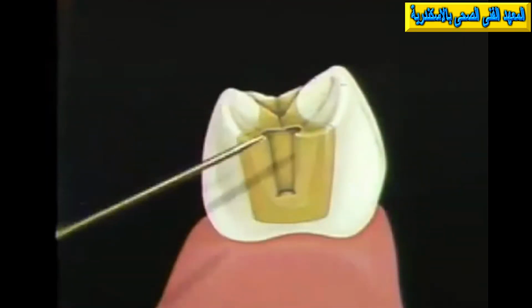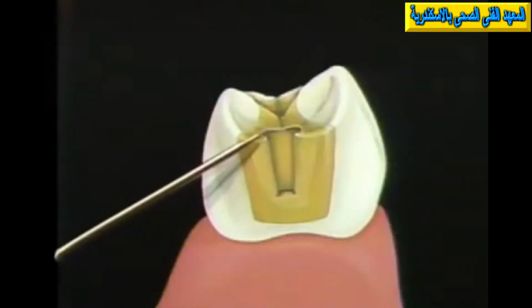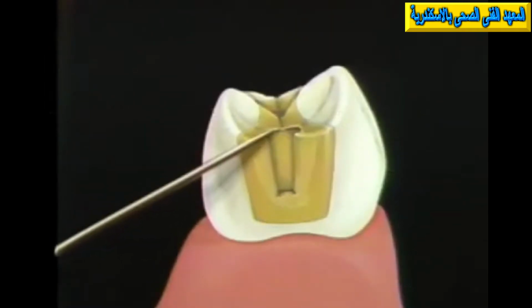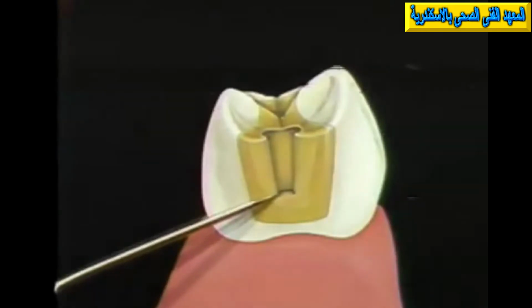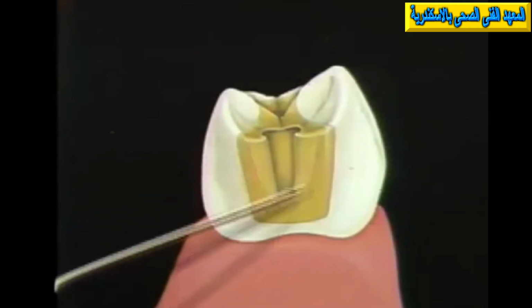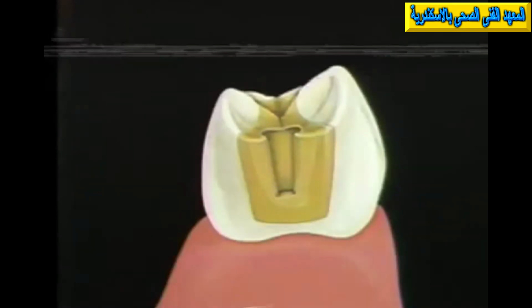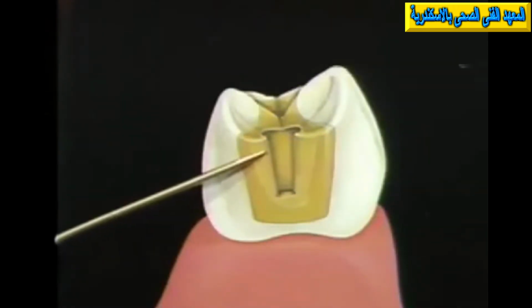And here you see a keyway which has been cut on a Class II inlay. The characteristics of this are that it should be about twice as long as it is wide, that it should have this retentive key form, that there should be a taper of about 5 degrees from cervical to occlusal to facilitate the waxing and the drawing and the insertion of the keyway into that. Notice also that usually a flat surface is cut on the proximal surface of the inlay, 3/4 crown, or whatever it may be. And it is into that flat which the keyway is cut.